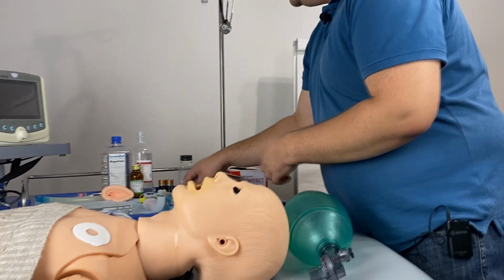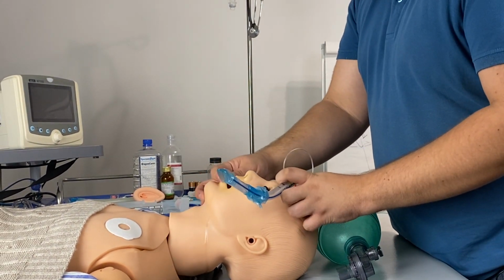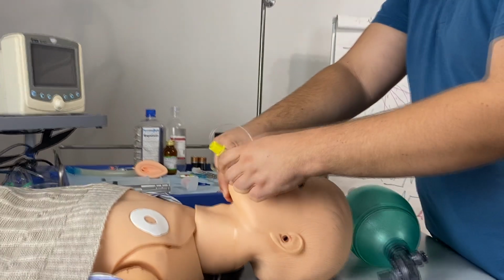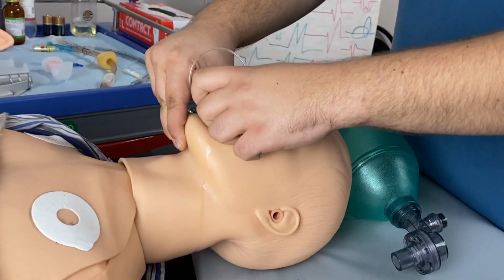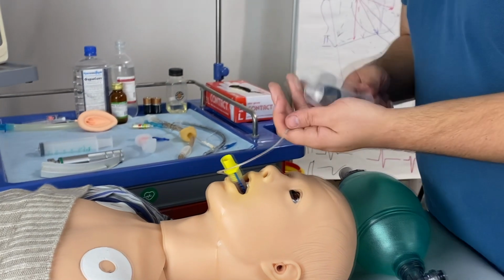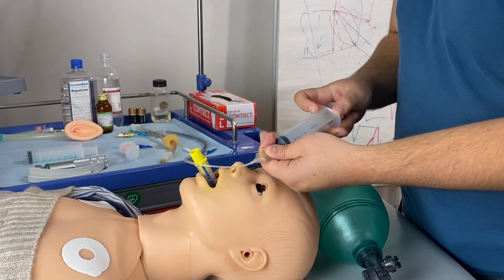Now, the laryngeal tube. We open the mouth of the patient, we can compress the tongue if needed. Then, without any really big force, but still directly, we push the tube down the patient until it stops. Then we take a syringe. Then we inflate the cuffs.